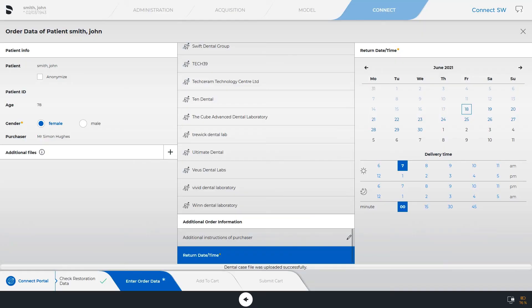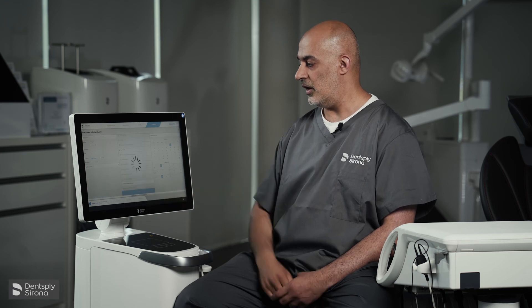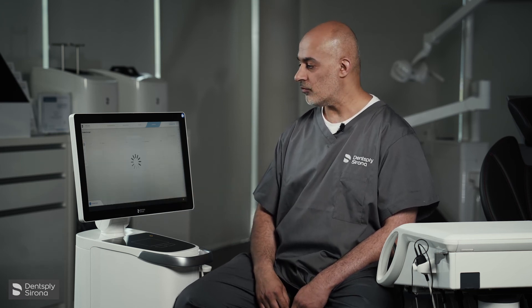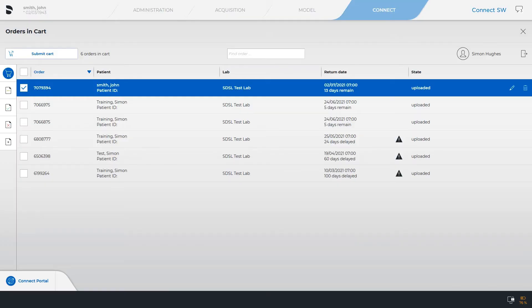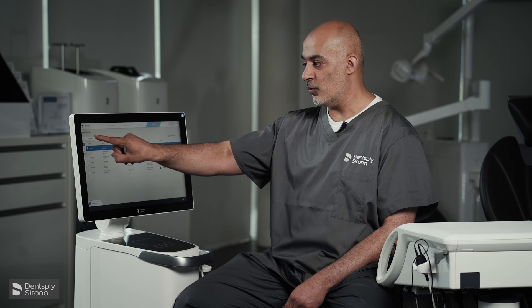Then enter the return date — it can be two weeks from now or a week. You'll see that as soon as you've completed that, the Add to Cart icon has been highlighted. We can now add to cart, and the patient details that you're sending will have a tick icon on there.